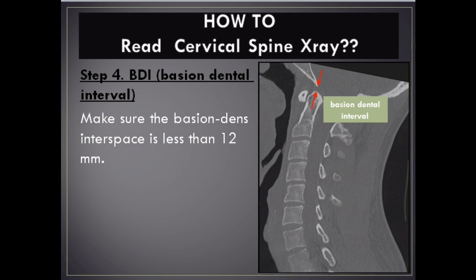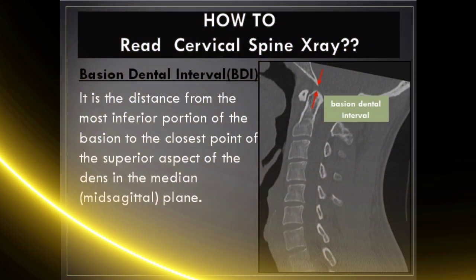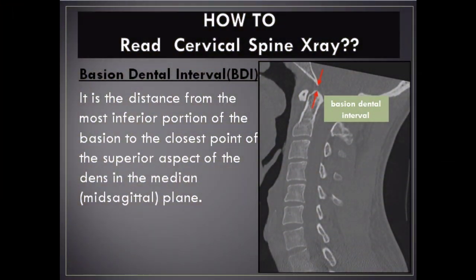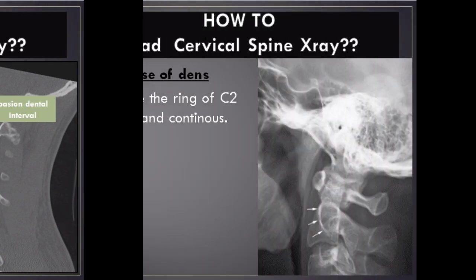Step 4 – BDI (Basion Dental Interval): Make sure the basion-dens interspace is less than 12 mm. The basion dental interval is the distance from the most inferior portion of the basion to the closest point of the superior aspect of the dens in the mid-sagittal plane.